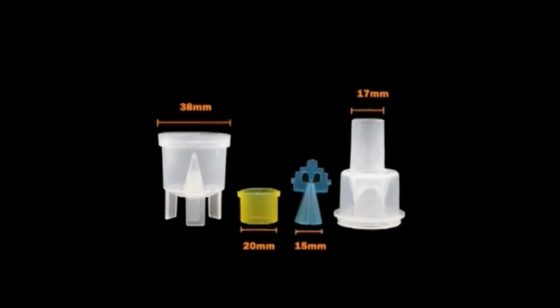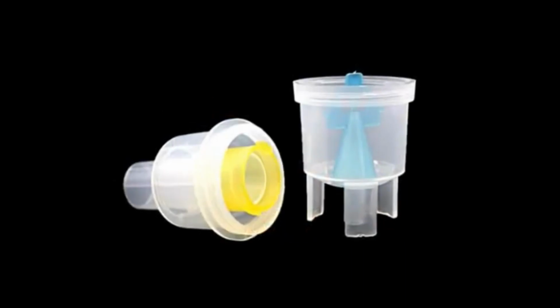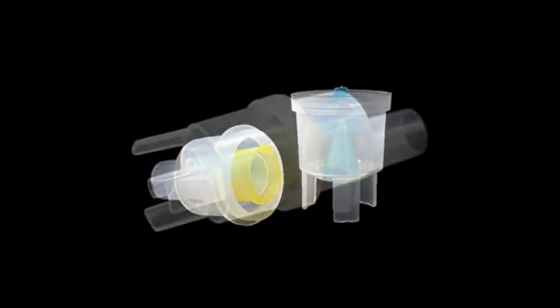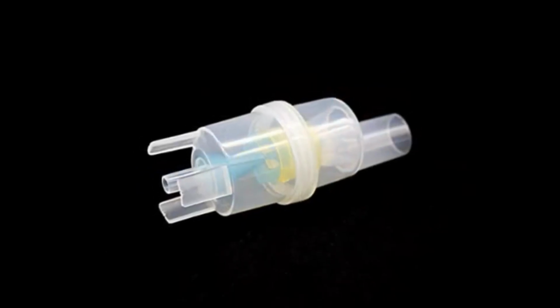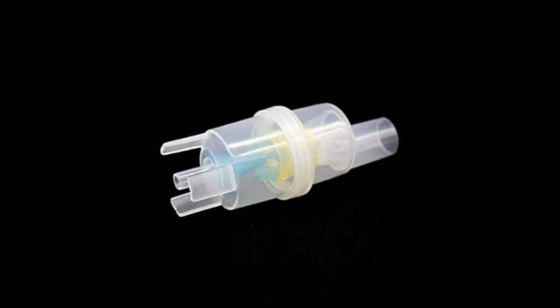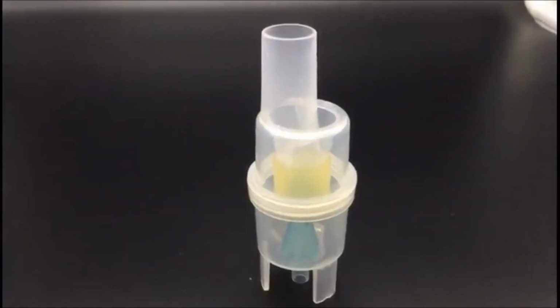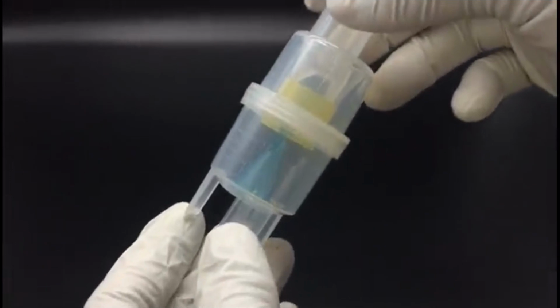To clean it, unplug the nebulizer. Remove the tubing and set it aside. Never place the tubing underwater. Remove the mouthpiece or mask, medicine cup, and top piece. Wash them in warm soapy water and rinse, or place them on the top shelf of a dishwasher. Remove the excess water and let them air dry on a paper towel until the next use.